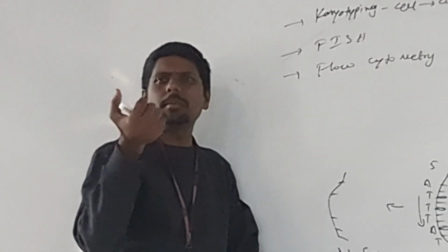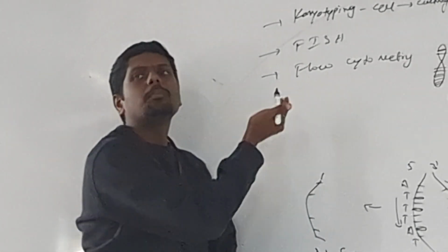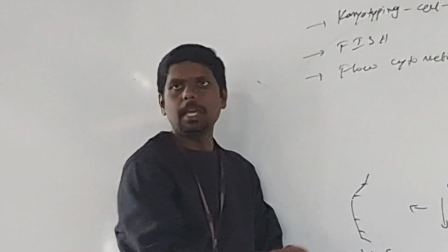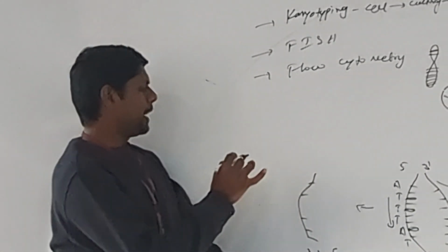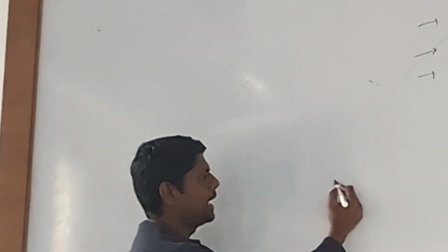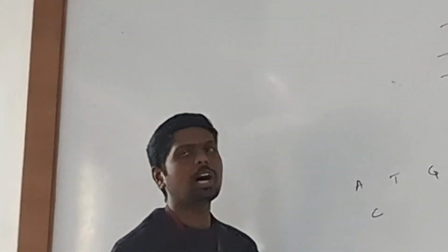Rough. The DNA becomes rough. There are no sequential base pairs. There are gaps. Now we are taking base pairs: adenosine, thymine, guanosine, or cytosine, and uracil in case of RNA.